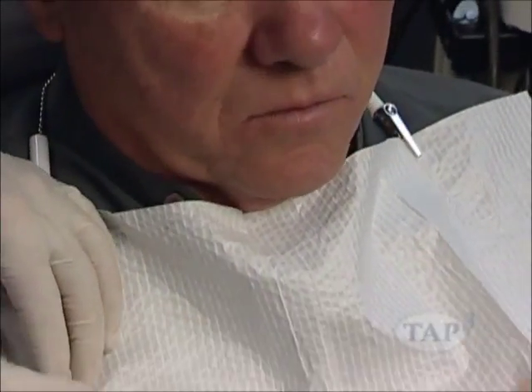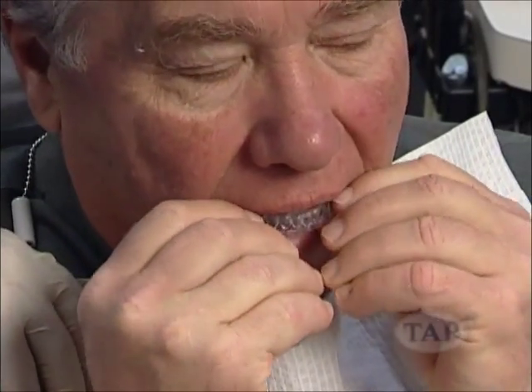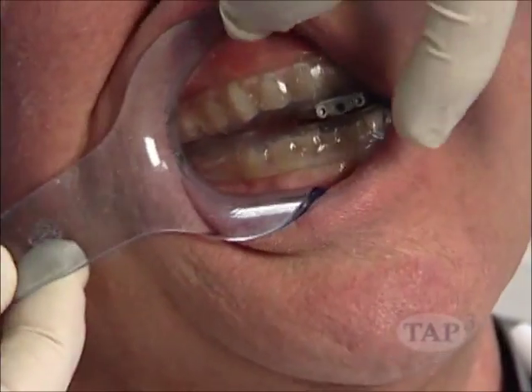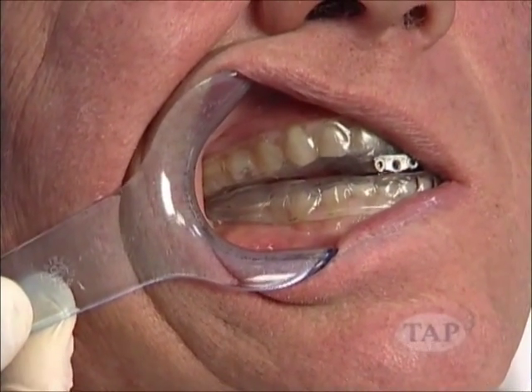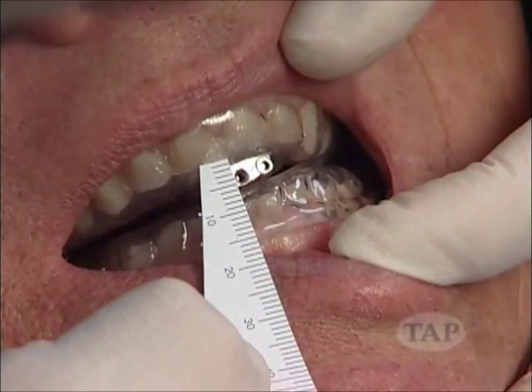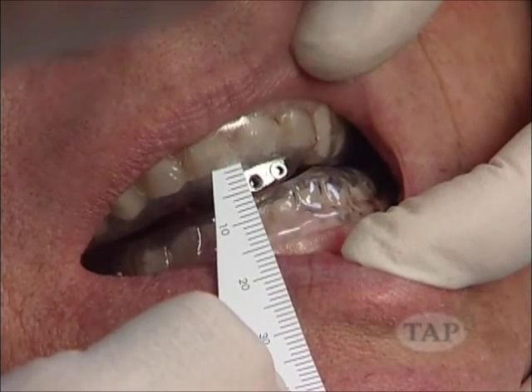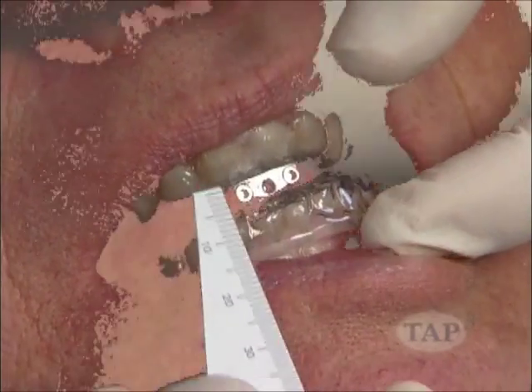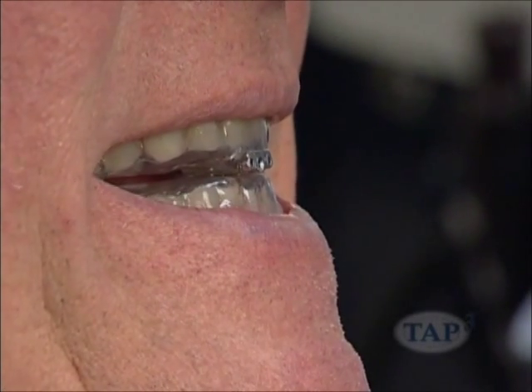Have the patient place the lower tray back in their mouth and hook the trays together. Check the posterior stops for fit and function. Make any adjustments necessary. When the TAP is in the patient's mouth, the final vertical opening is kept to a minimum of 6 millimeters. This allows lip competence, which improves the patient's comfort.